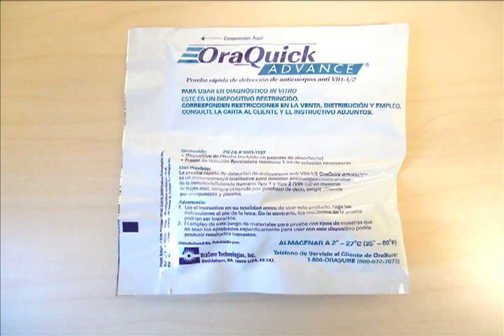We will demonstrate 2 of the 3 ways that this test can be performed: the oral fluid procedure and the finger stick whole blood procedure. The venipuncture procedure will not be included in this video.